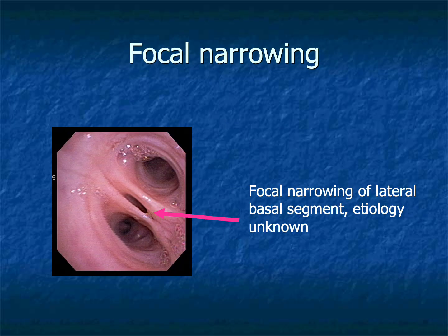Focal bronchial narrowing is a common finding during bronchoscopy. The cause may be inflammatory, post-infectious, congenital, neoplastic, traumatic, or occasionally unknown. Whenever focal narrowing is encountered, carefully document its location, appearance, and severity, and whether there is evidence of associated mucosal abnormality or external compression.